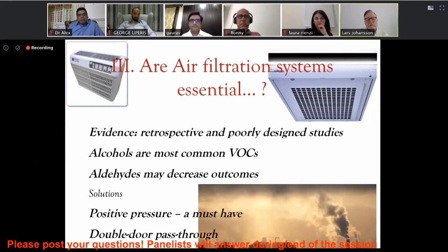And for the potassium permanganate, it's actually oxidizing the VOCs, but it doesn't take away all these VOCs. And there's also been shown recently, which I was supposed to talk about in Aspire, that the VOCs are actually taken up in oil and furthermore enriched in the culture media.